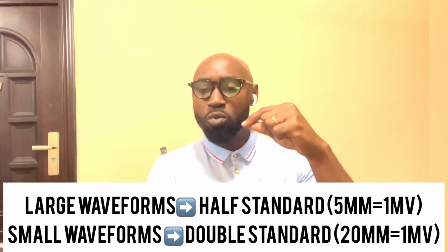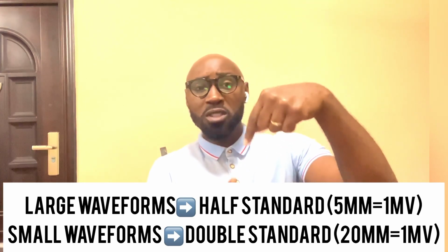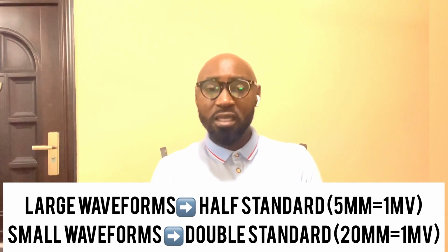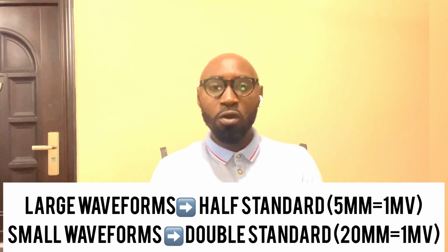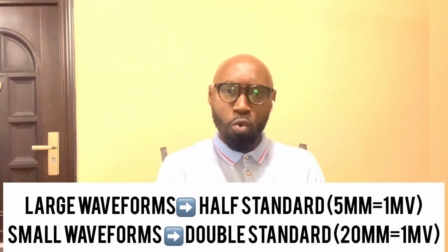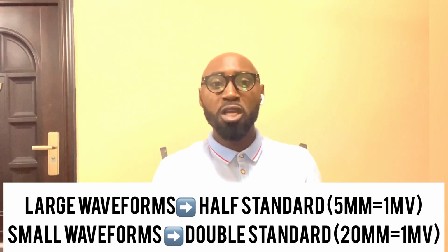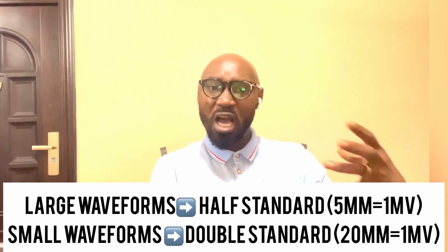So for example, sometimes we find that the waveforms may be way too large. They may be too large so that even some of the waves may be projecting into each other. In that case, it is possible to operate at a half standard of say 5 millimeters to be equal to 1 millivolt, as opposed to the standard of 10 millimeters being equal to 1 millivolt, so that some of these waveforms can be reduced for better appreciation.